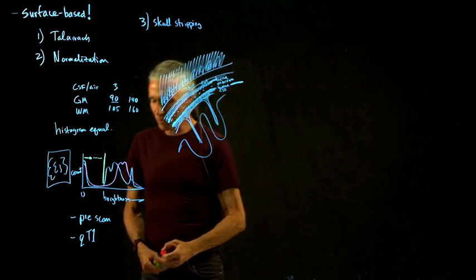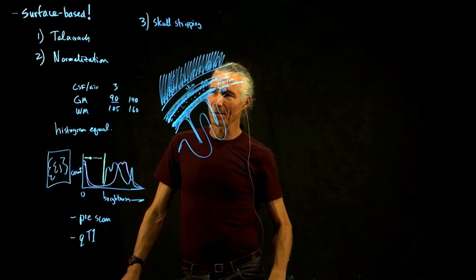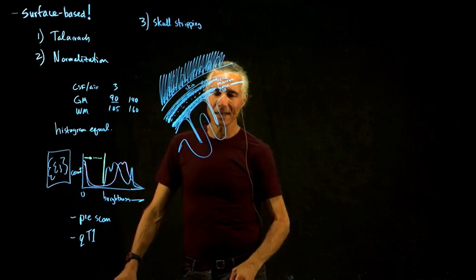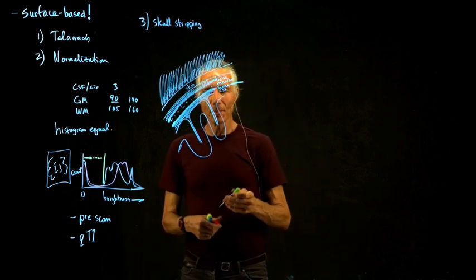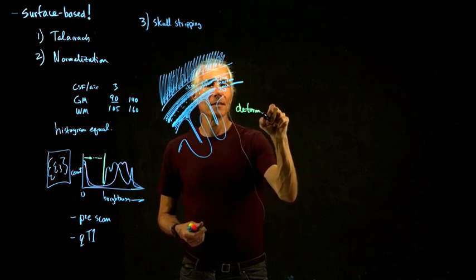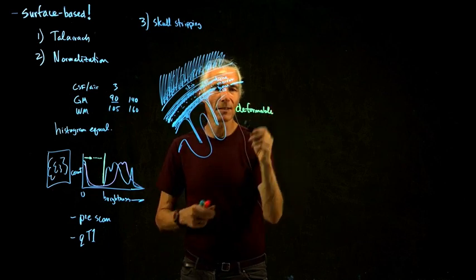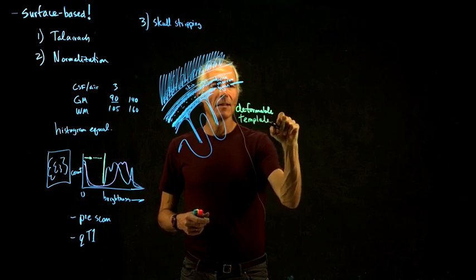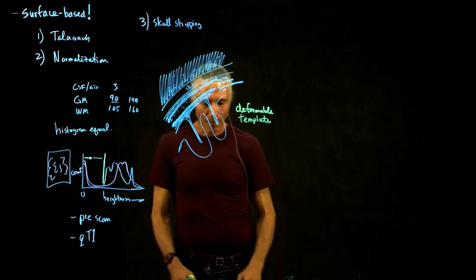So this is something that Anders worked out way back in the day, probably 1991 or something like that, 1990. And so this is a method of using a deformable template. And this has been copied in FSL, so the skull stripping in FSL works the same way. So this is a method that people in sort of visual object recognition had used.